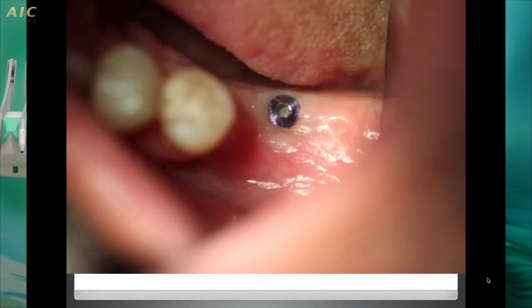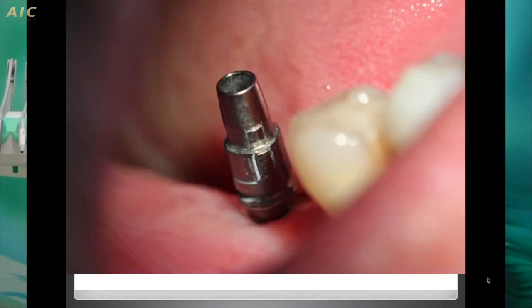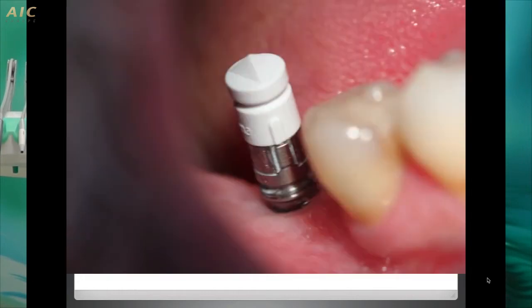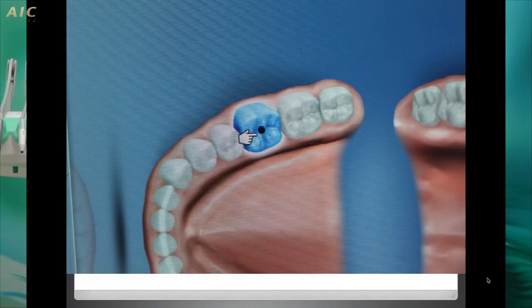and then we go further on in this webinar, okay? So, when we place one implant, after that we are going to put your scan post, and then you are going to put your scan body over it. So first the scan post, and then the scan body, okay? After that, we are going to choose the tooth that we are treating. In this case, it is the 47. Now we are going to select the scan post or the TiBase.